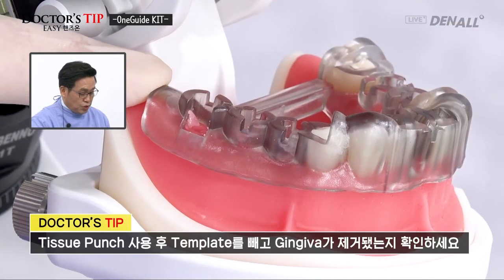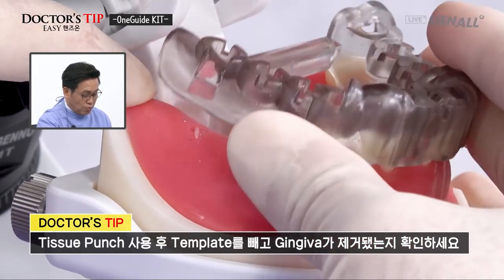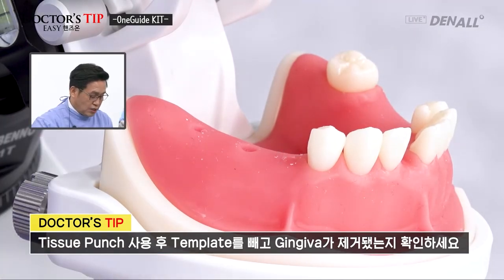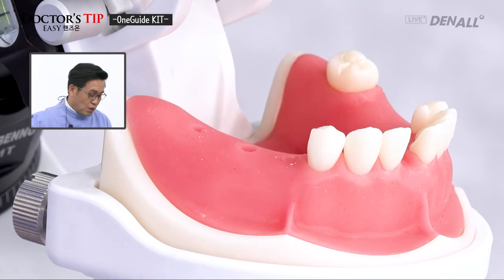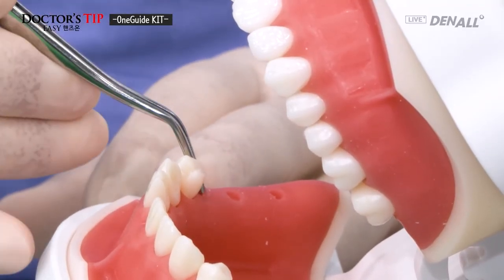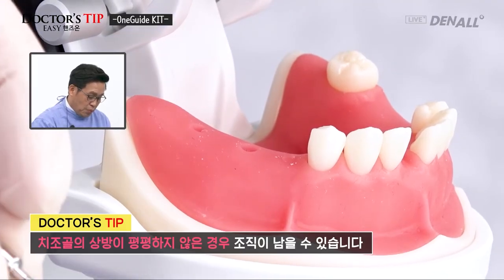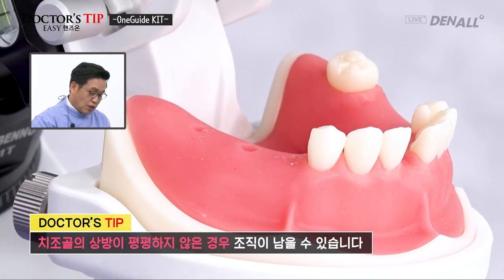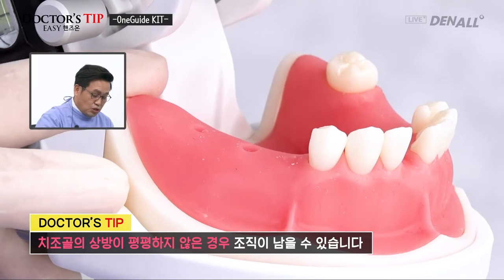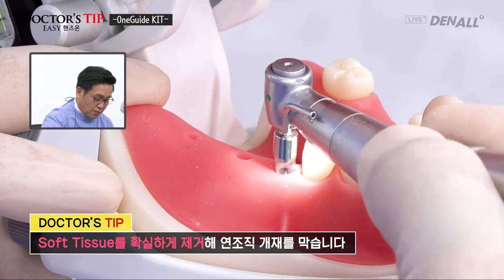After you do the tissue punch, if there's remaining gingiva, in those cases, remove the template and check if the tissue has been thoroughly removed. 46 and 47 have been removed well. Number 45, there's still a little bit remaining. If the surface of the alveola is not flat, sometimes tissue can remain. If there is soft tissue, if you do drilling, there's not a huge issue, but there can be soft tissue impaction, so you remove it like this.